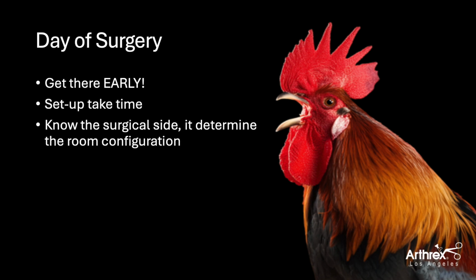With that being said, if it's a right side pathology, the surgeon and the scrub tech are going to be on the right side, and on the left side of the patient is going to be the C-arm video monitor, our video tower, and sometimes the C-arm depending on room configuration.